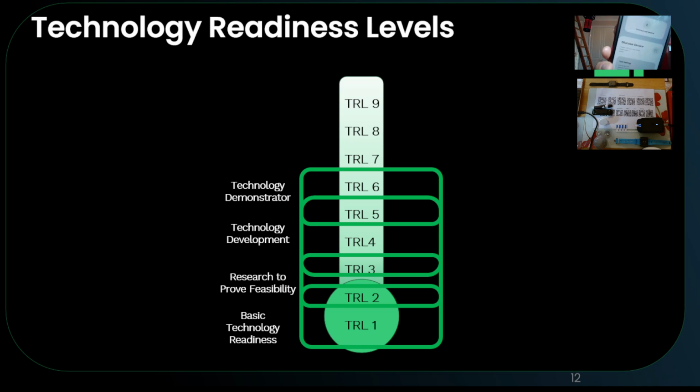Maybe I should talk about that a little bit deeper. I've got something in front of me called the Sense It All. It's a potentiostat, but it's more than a potentiostat. It's also a way of delivering point of care diagnostics earlier to applications than would otherwise be done. But Sense It All is at a higher technology readiness level. So sometimes the paper's useful, but it's going to be such an effort to raise that particular paper to a higher technology readiness level. It's actually going to be too much.